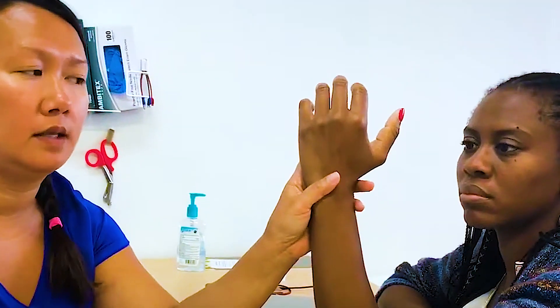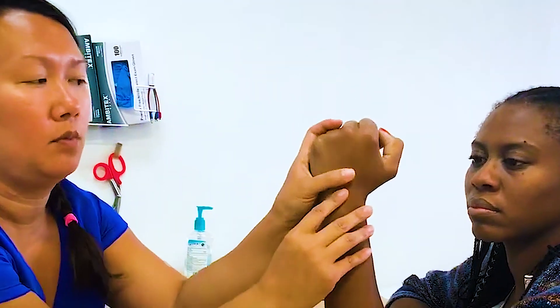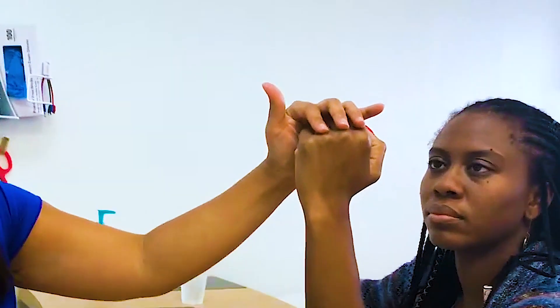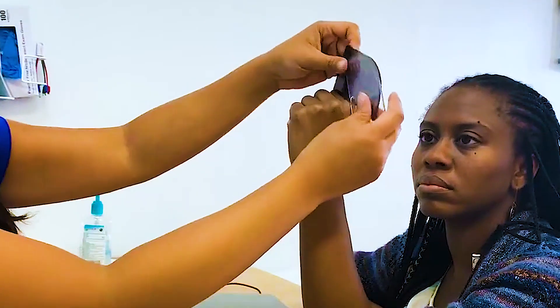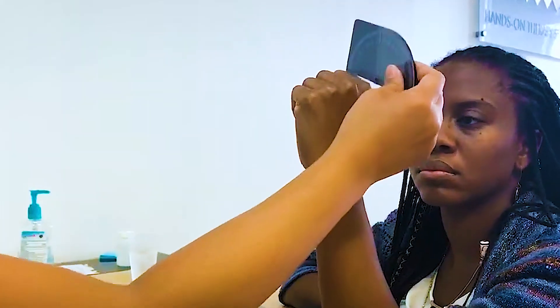When you are asking someone to make a fist, you want to make sure that their wrist is slightly extended. If they're trying to make a fist and their wrist curls down, you want to give them a little bit of help and make sure that they keep their wrist slightly extended. You can do MPs and then IPs, or IPs and MPs — it doesn't matter as long as you remember what you're doing. So we're going to measure flexion. This is 80. I remember all four numbers and then write all the MPs down.